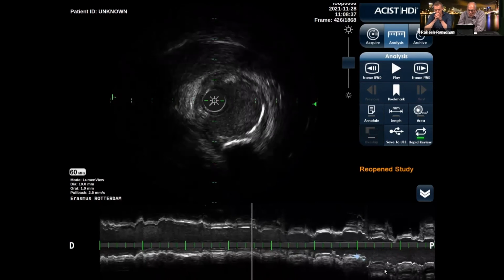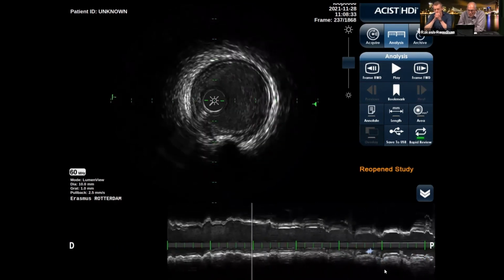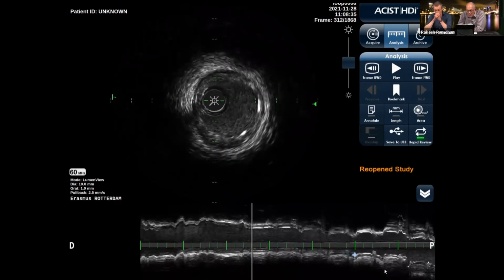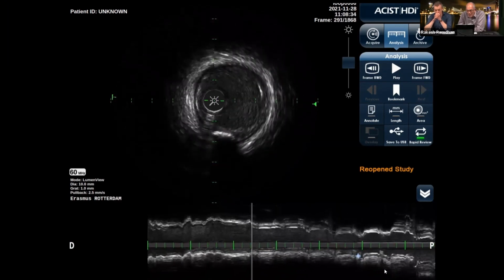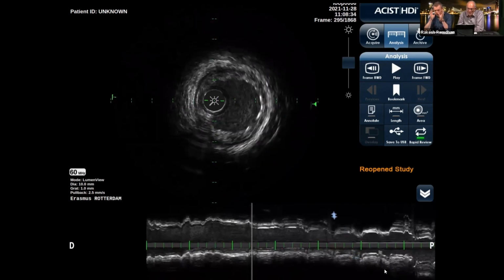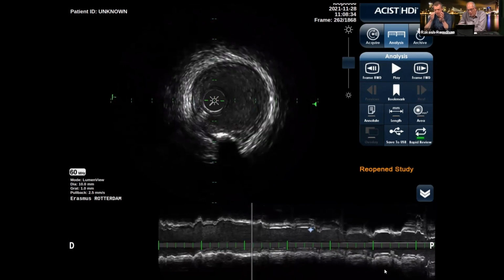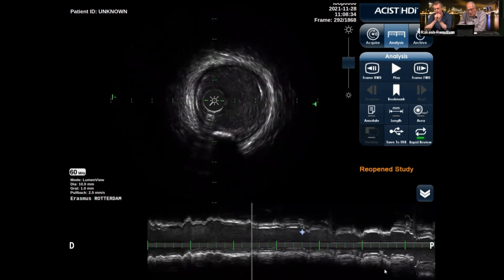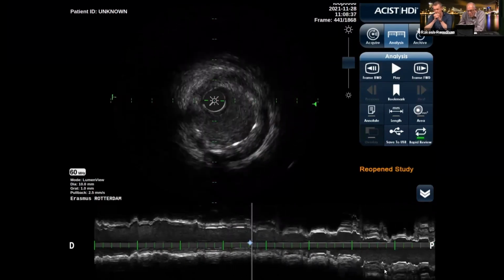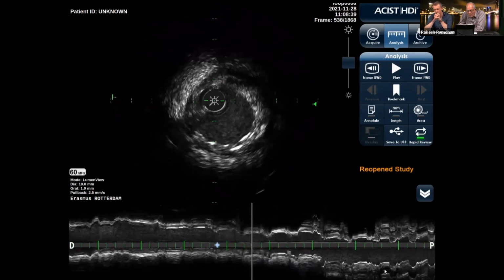Now here's the result, and they placed a stent in here. And if I look in here, I don't see any edge dissections. So this is nice. This stent expansion is really nice because it is almost identical to the distal reference lumen area, as you can see. That's a very nice transition. So not like in the previous case where you landed in the plaque and it was under expansion. Here, the stent was nicely ending in a healthy reference segment, as it should be.